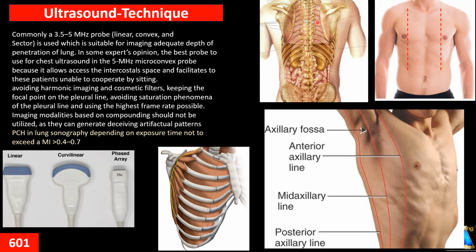For posterior, the same way. In the inferior part, we have to see the diaphragm and part of the liver and lung. That will be our shot for each side.